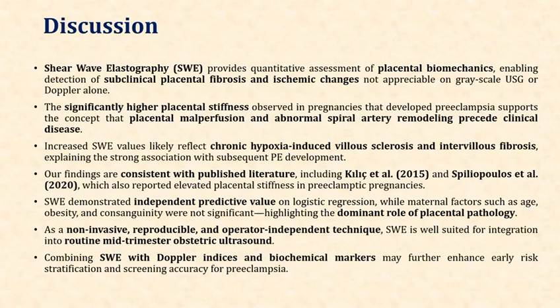Shear wave elastography provides quantitative assessment of placental biomechanics, enabling detection of subclinical placental fibrosis and ischemic changes, not appreciable on grayscale ultrasound or Doppler alone. The significantly higher placental stiffness observed in pregnancies that develop preeclampsia supports the concept that placental malperfusion and abnormal spiral artery remodeling precedes clinical disease.